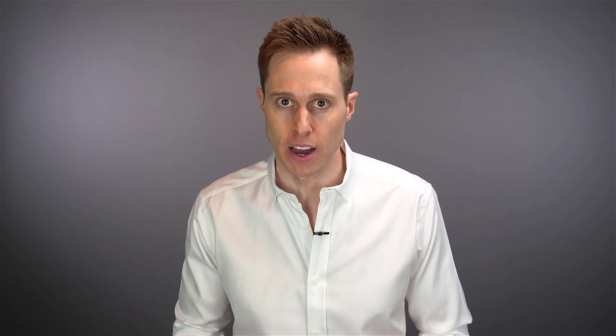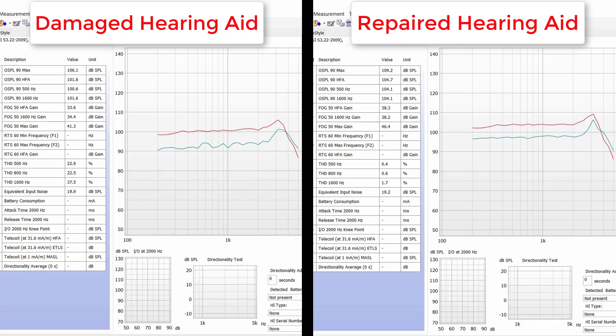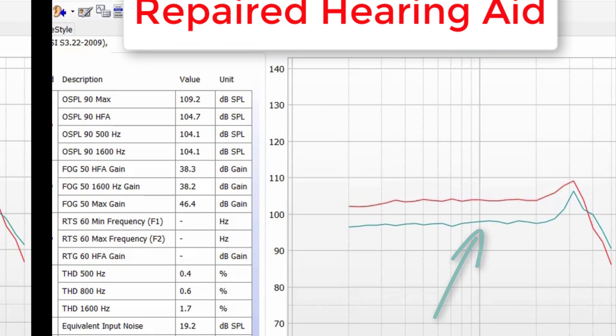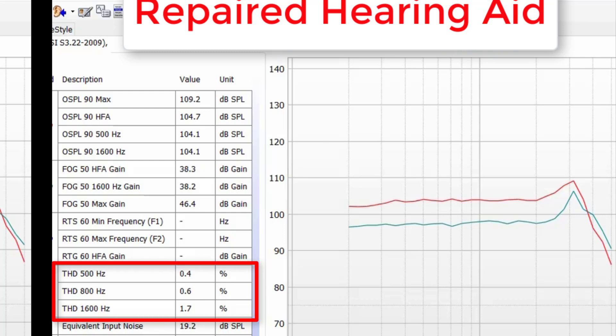Now that we've identified that this hearing aid is clearly not meeting manufacturer specifications, even though it sounded good to me before running it through these diagnostic tests, let's see how it performs in the test box after repair. Here's a direct side-by-side comparison: the device when it was outside manufacturer specifications is on the left, and the new measures after repair are on the right. The turquoise curve for the repaired hearing aid has been smoothed out. The OSPL-90 Max has been increased but is still within the tolerance range of 114 dB SPL. The OSPL-90 HFA has improved to 104.7 dB SPL, now within specs. The FOG-50 HFA gain has increased significantly to 38.3 dB, which is also now within specs.